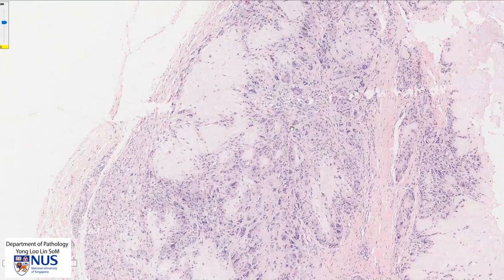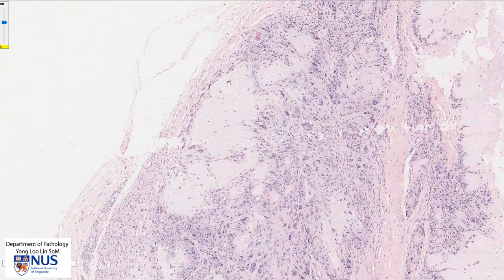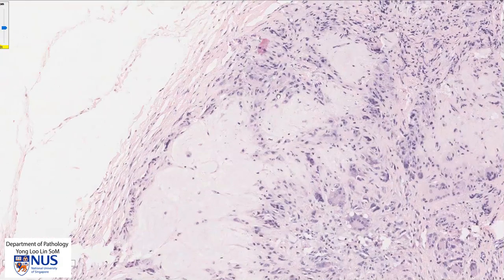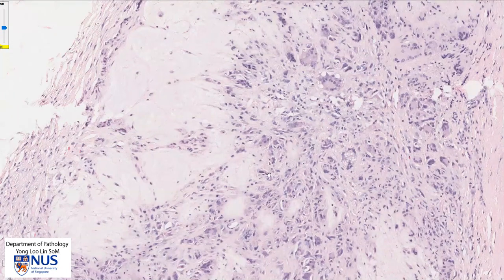In summary, the histologic picture of the gouty tophus shows the presence of pale pinkish amorphous deposits. They are surrounded by a rim of histiocytes, which include mononucleated macrophages or histiocytes as well as multi-nucleated histiocytes. Thank you.